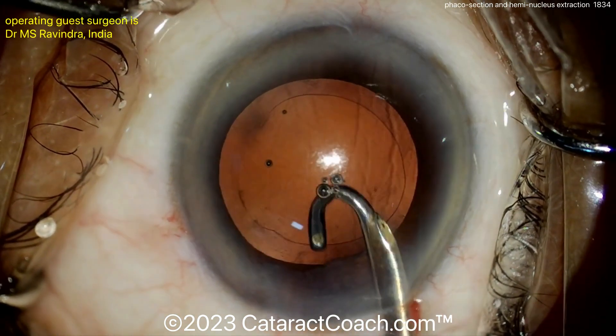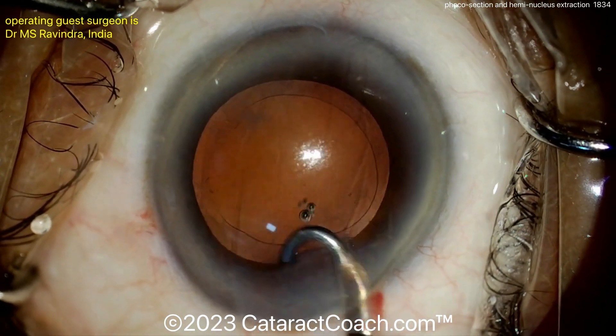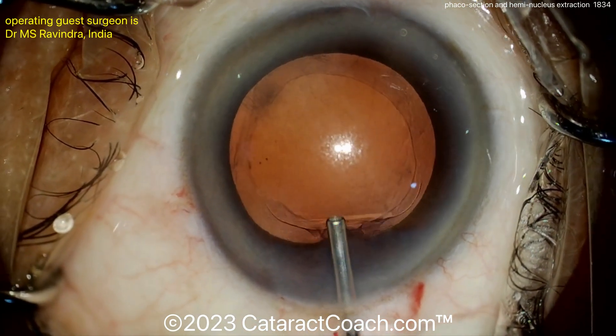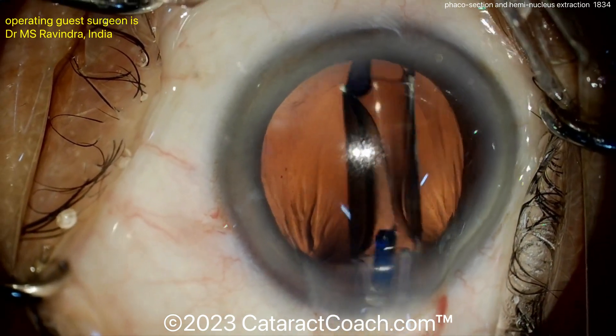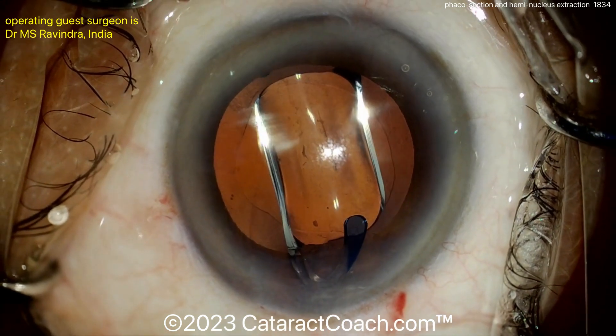When I do SICS I tend to put at least a suture in the larger incision, but I think if you did a scleral tunnel and did this size incision — let's say four and a half millimeters — certainly with a scleral tunnel you can get away with no sutures. In this situation I think the surgeon is using more of a limbal incision and less of a scleral tunnel.